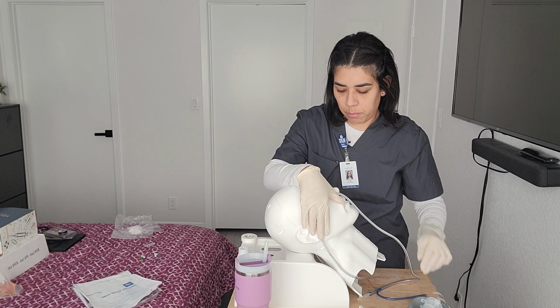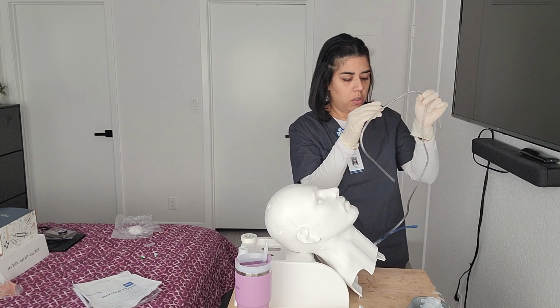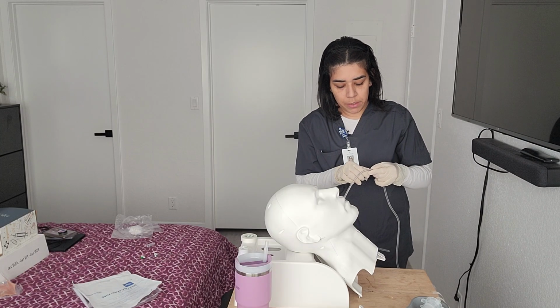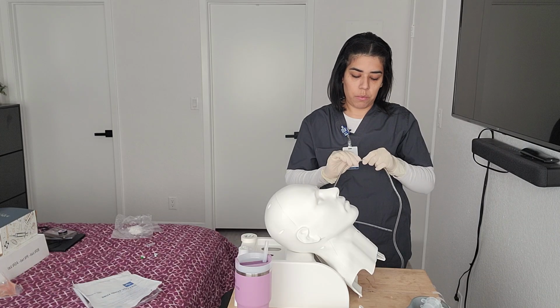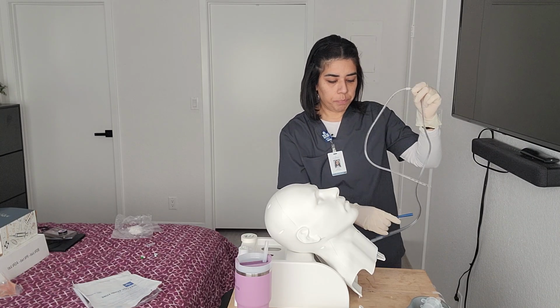So we're looking at about 50. So we're gonna put our tape here as a marker for where we are gonna stop. This is our stopping point once we reach the nostril.